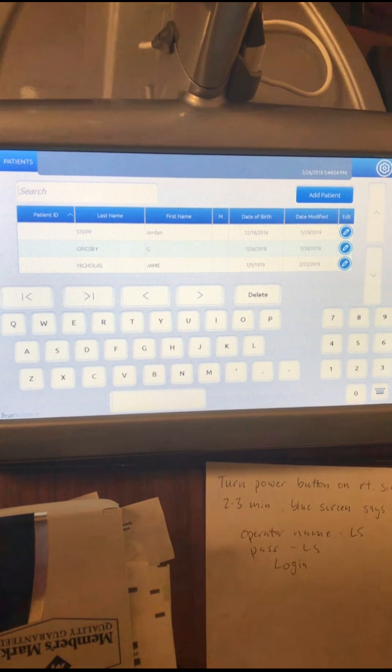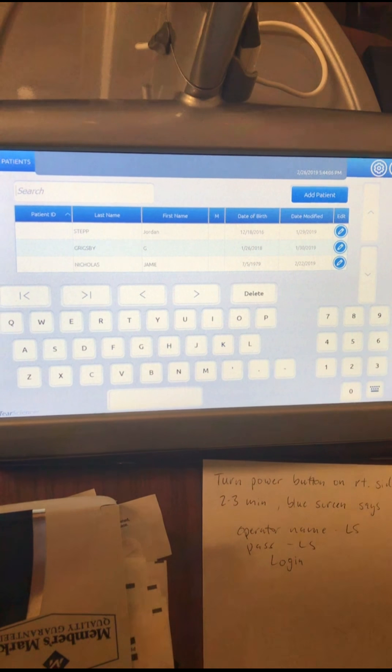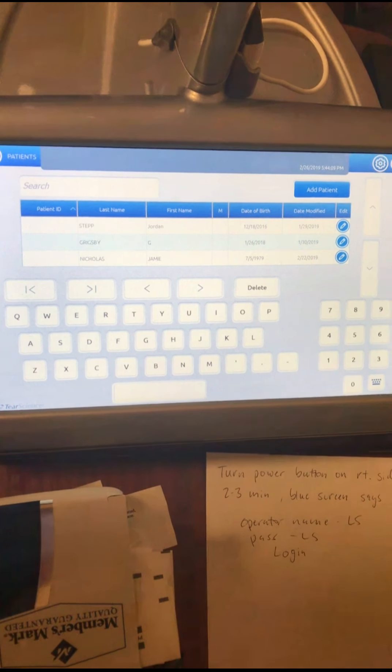So you touch it, then it's gonna ask for operator name. The operator name is LS. The password is LS and then you hit log on.